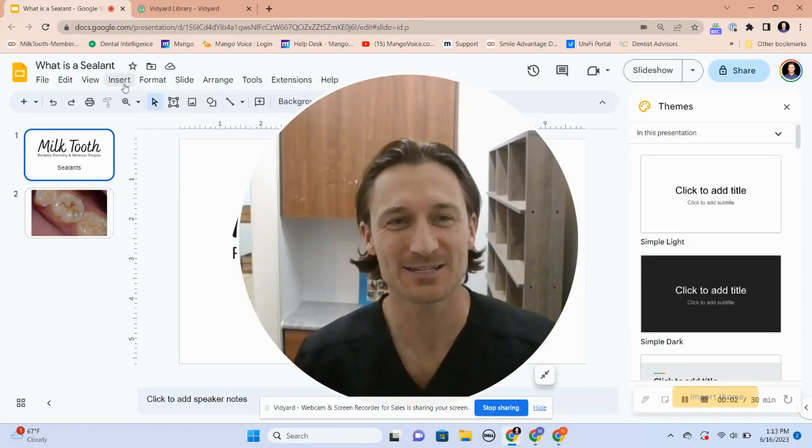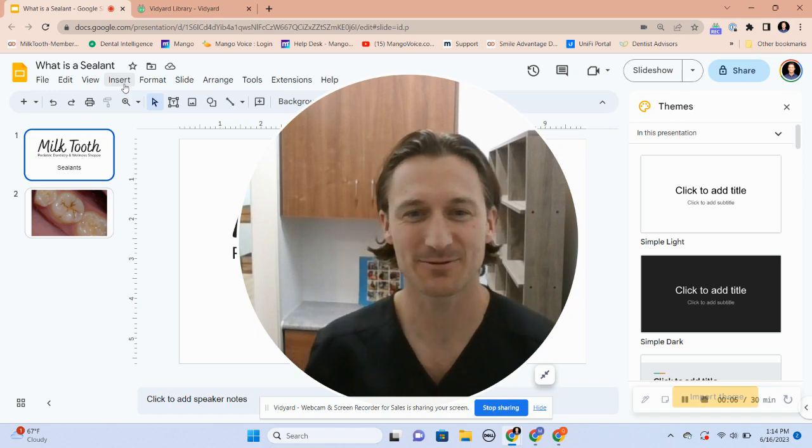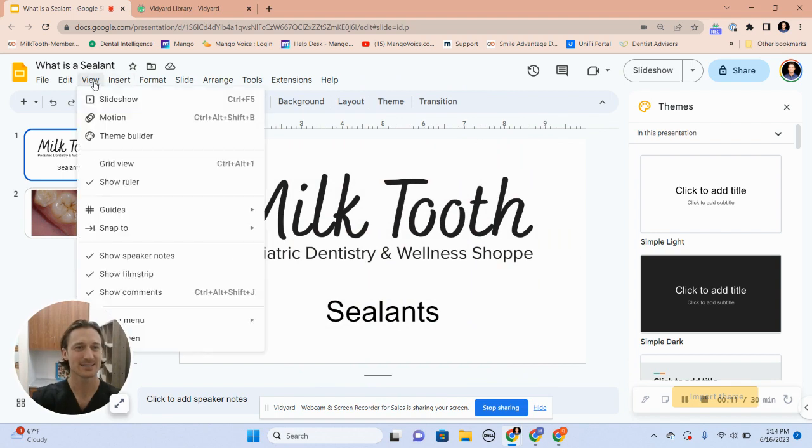Hey, this is Dr. Quinn. I just wanted to give you a quick 30-second video about what the sealants are that we planned, so that way you better understand the procedure. I'll go ahead and take this down here and we'll just go ahead and take a look really quick.